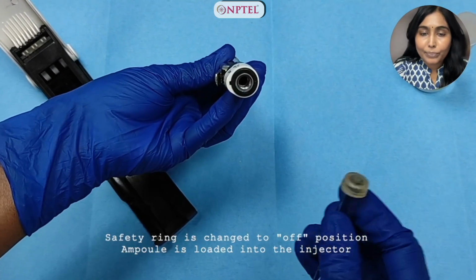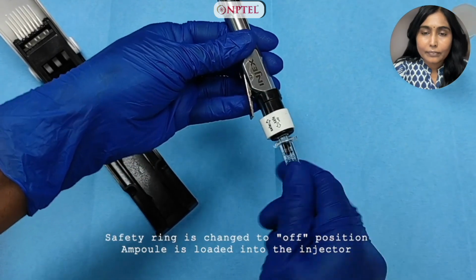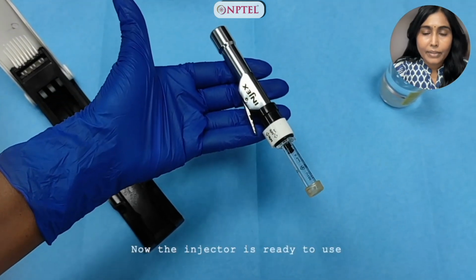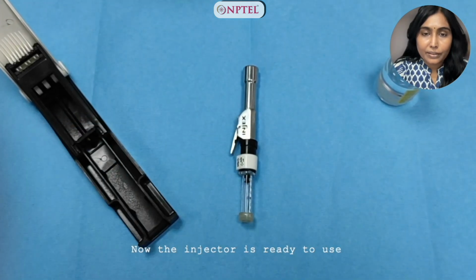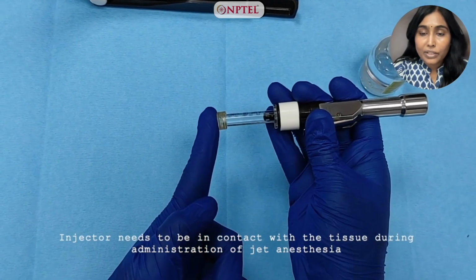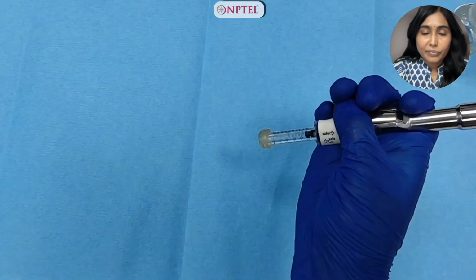I'm going to load the ampule now into the injector by simple twisting motion. Make sure it's firmly seated, and now it's ready to use. The injector needs to be in contact with the tissue during administration. That's very, very important for effective anesthesia.